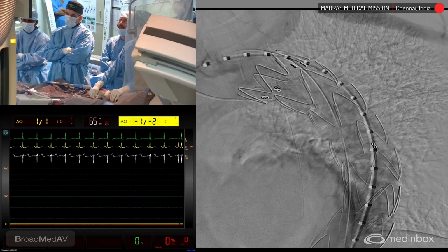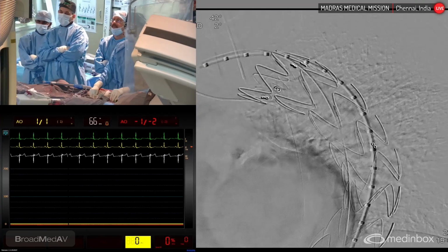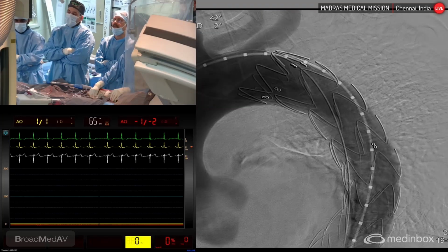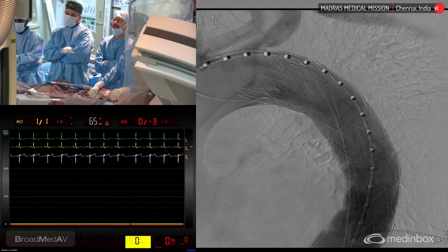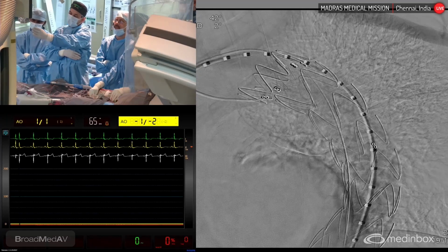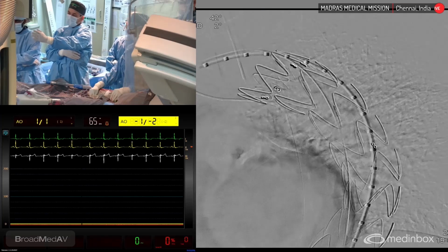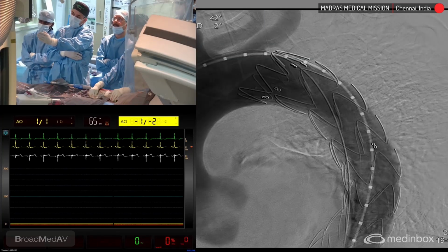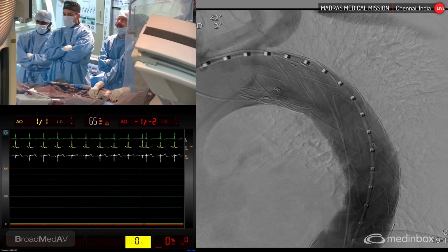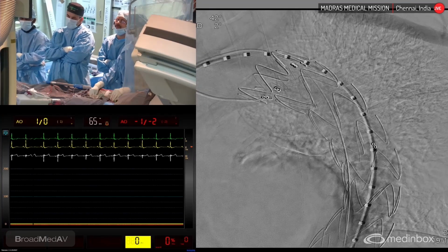It's very important to have a prolonged cine to see the delayed endoleak. Start breathing. So what's your comment on this? You don't see, I mean, previously also we didn't see a sac, but as such now visualized and you don't see. That outpouching is not there and you don't see any delayed dye filling also.